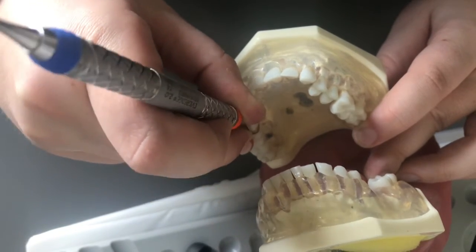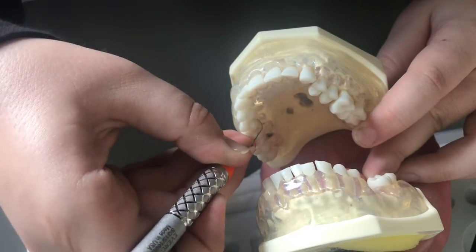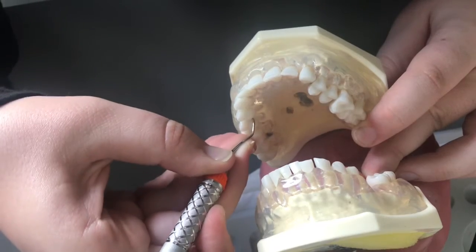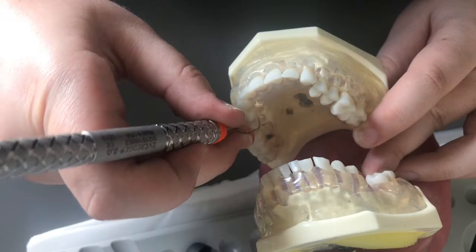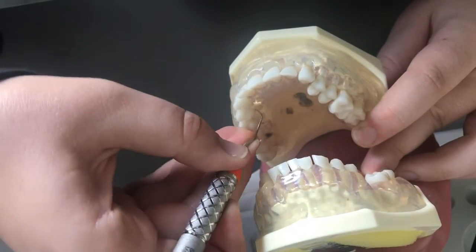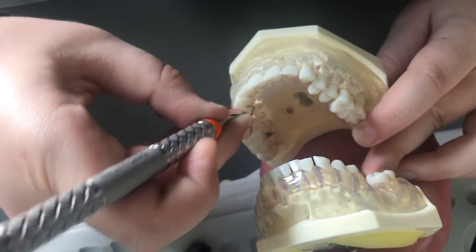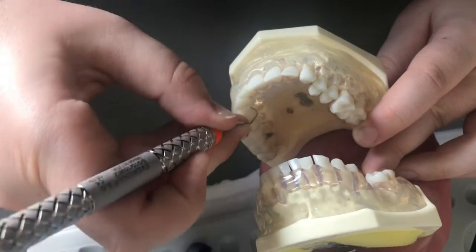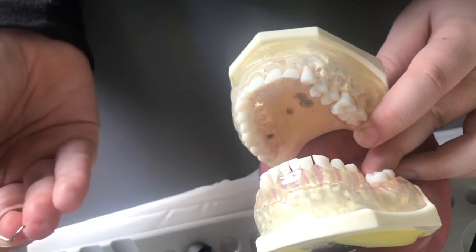Still keeping that blade closed, starting back behind that distolingual line angle. That way we can overlap the spot where we started with our 13-14 and then come out. Making sure that even while going around the tooth, your terminal shank stays parallel with the tooth. Then coming out.